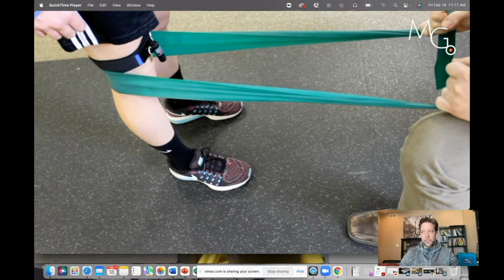They can't nail this. Well, I'm not going to allow them to go home on a Thursday to not get to my clinic until Tuesday and have them perform 4 or 5 days of inefficient quad function. I need them to get this in their first week in the clinic. So if they can't show that they can do this with the efficiency, they're going to get a patient pack for home. Okay, and I'm just going to sell them that. I'm going to tell them, hey, you don't want to get behind. I highly encourage you to get this. They can make their own decision, right? But this is the easiest way to make sure that they're doing the home exercise program efficiently and correctly at home.